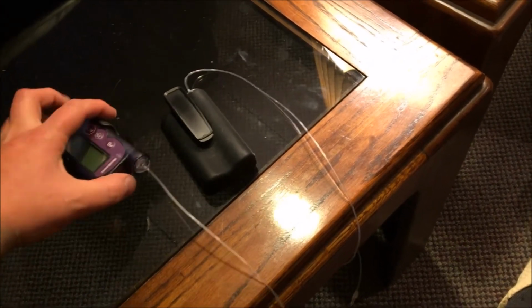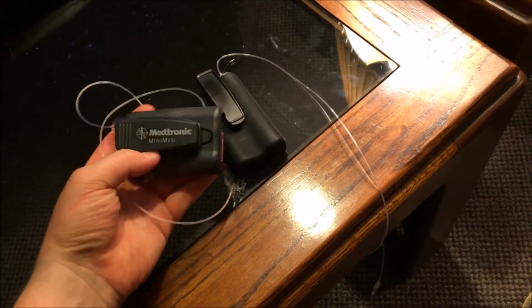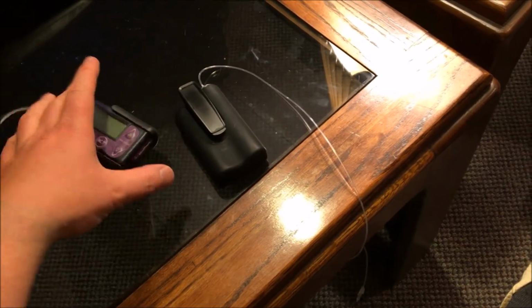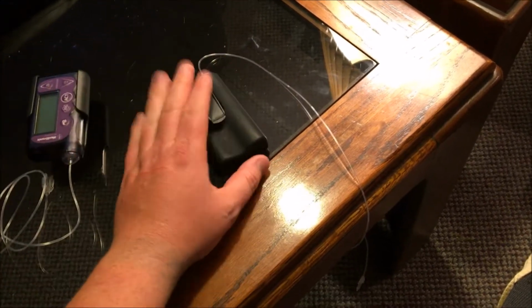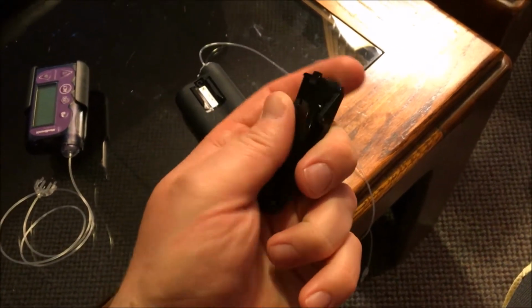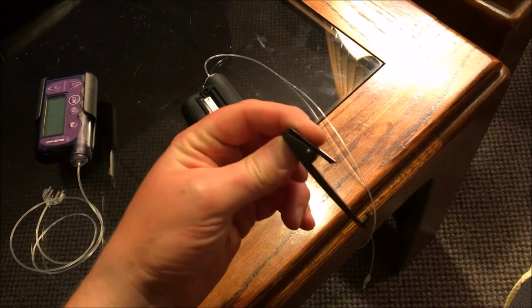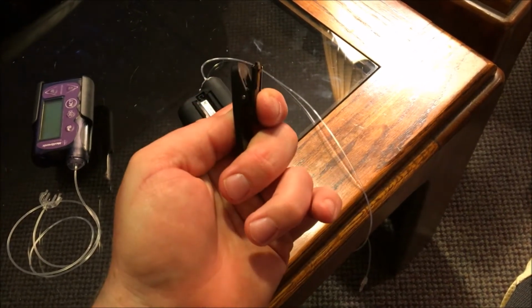So I definitely preferred this method. Now the problem is these would break all the time. This back here would break off, and I'd have to buy these all the time. They're like 17 bucks. And eventually I met somebody who gave me a replacement for free. So I've had a replacement for free before, but $17 a pop, and you know, they would break, but lots more convenience. This, I have had issues with this metal rod piece slipping out, sometimes half the way, and I had to take a little hammer or something and push it back in there. So I know that this is not very durable either. It has held up for a while for me, but I have to keep putting the little metal rod back in.